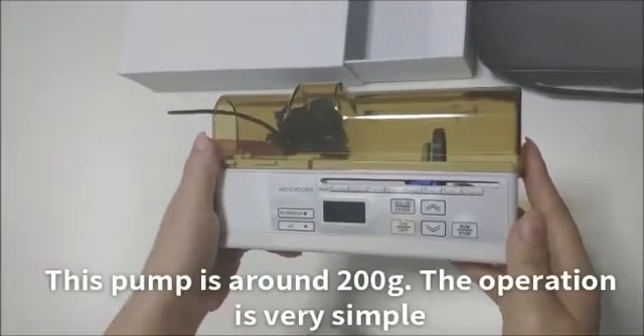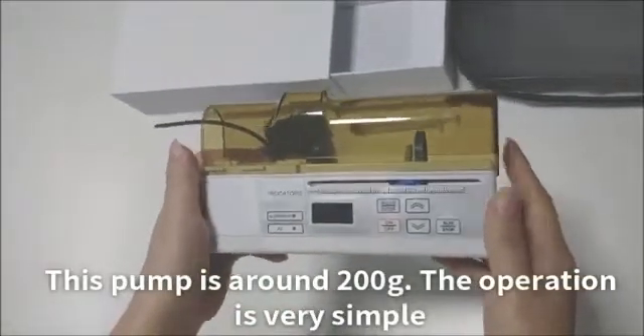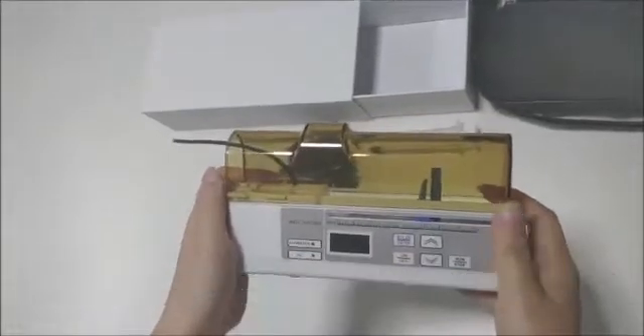This pump is around 200 grams. The operation is very simple.